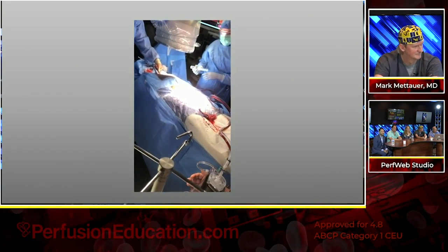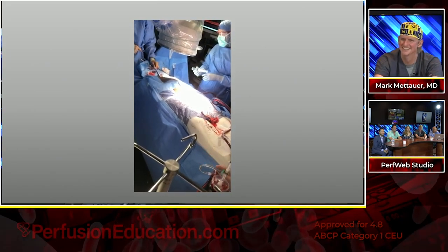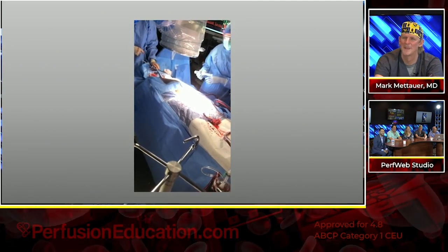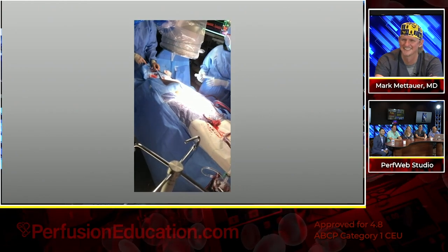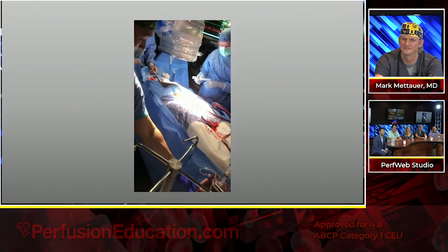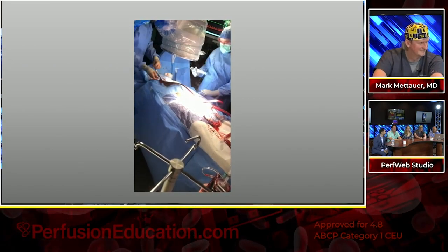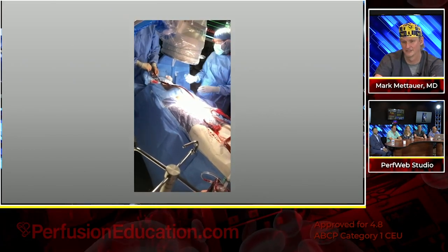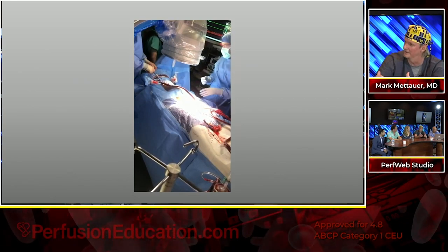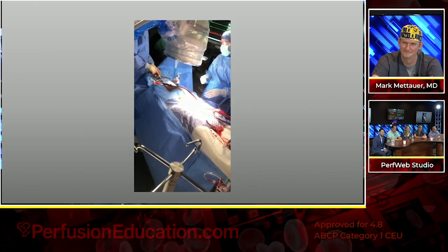Okay. Oh, we're going backwards. Yeah, pull your thing. More power. Either push it in further, do something. I just did. There's a lot of resistance. What kind of flow do you have? It's too negative. It's trapped on something. Well, as we found out today, there's no too negative. It was working hard, man. You could see air developing in the lines today. Are you serious? Yeah, cavitating. Turn it up, man. Turn it up.